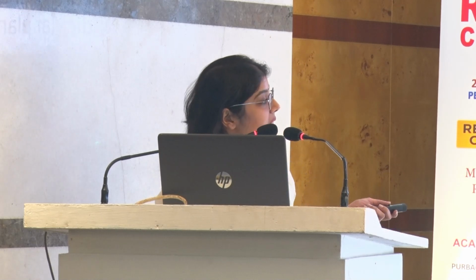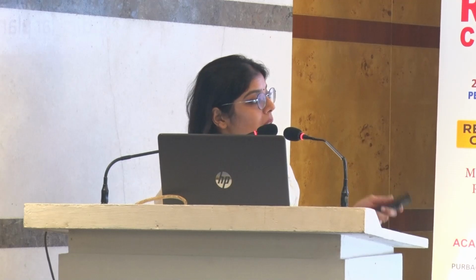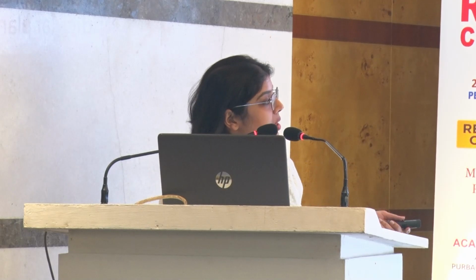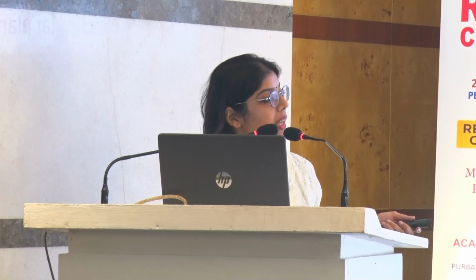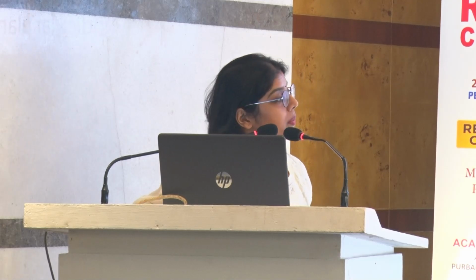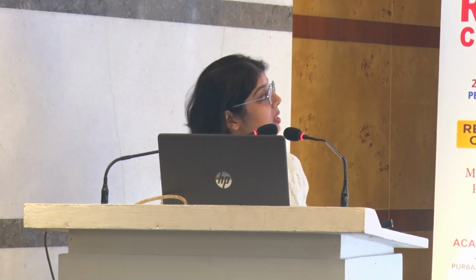So how do we detect erosions? Erosion is any discontinuity in the bony surface. So this is a metacarpophalangeal joint. Ideally this should have been straight like this, but we can see a discontinuity in the bone. So this is called an erosion. But to say definitely that it's an erosion, we should look at it in 2 planes. So this is the longitudinal scan and this is a transverse scan. In the transverse scan, we can see the same erosion in the transverse view. So only after seeing it in 2 perpendicular planes can we call it an erosion. So ultrasound is very specific for diagnosing erosions.